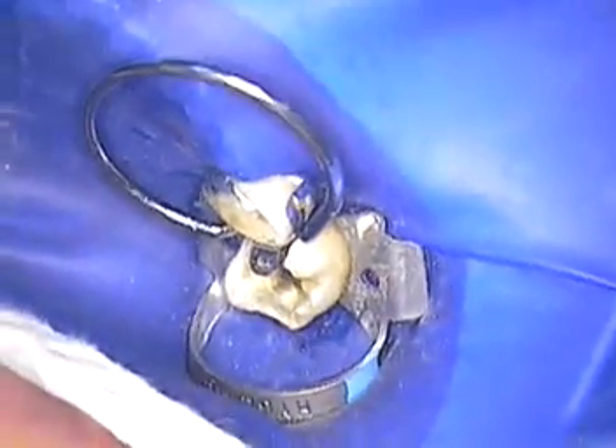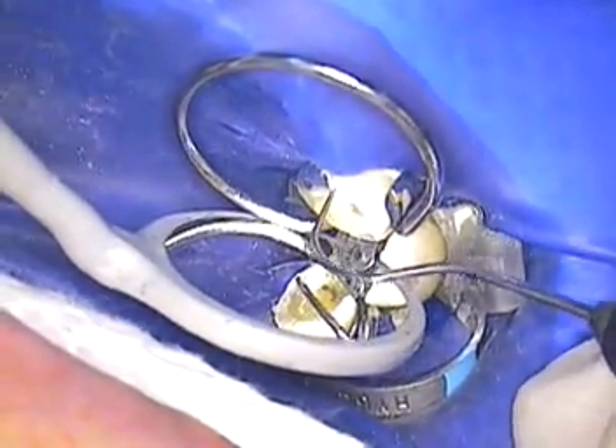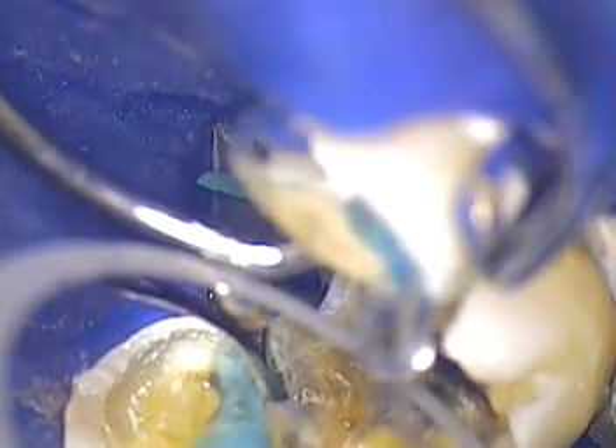We're going to build this entire lingual shelf back — all of this right here. We're gonna bond to that enamel, and we're gonna etch all the way around 360 degrees. We'll do that one first, so we're going right to etch. She passed me this — it's 34% phosphoric acid — and we're gonna put that on all over the enamel.